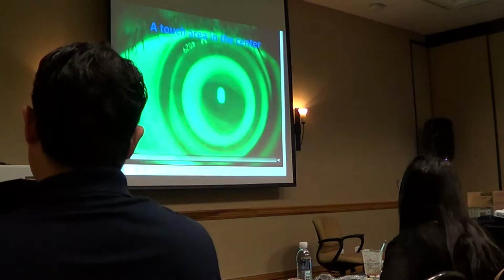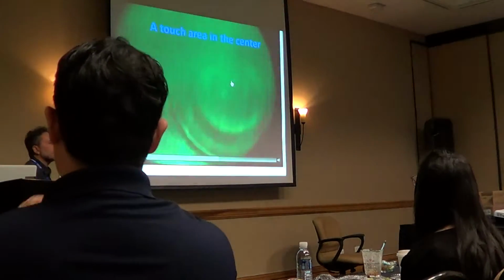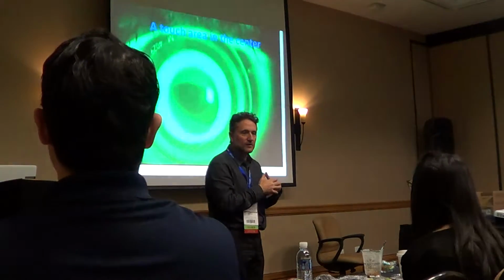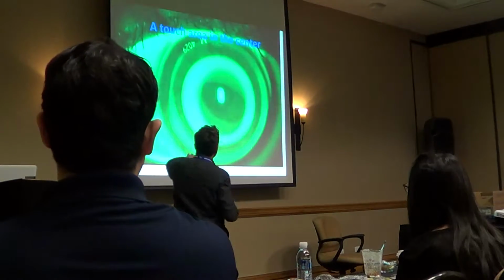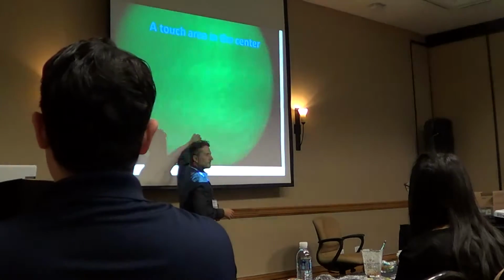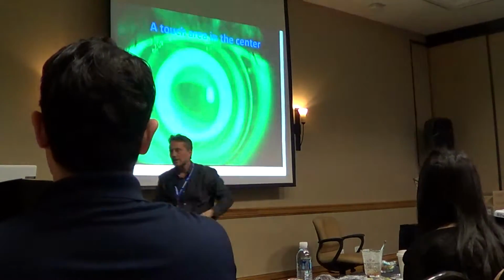This is very clear. The lens is good. You could provide the lens, but you have no tear film under the back optical zone of the lens. So you could have some contact there, and because the lens in this area is not well aligned, maybe because you have some toricity, the lens will move around all the time. What happens?